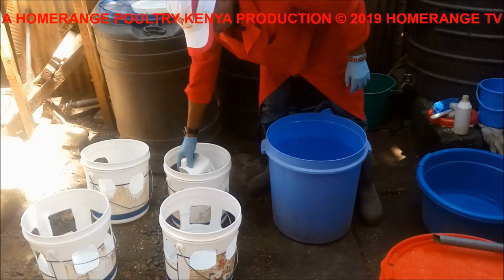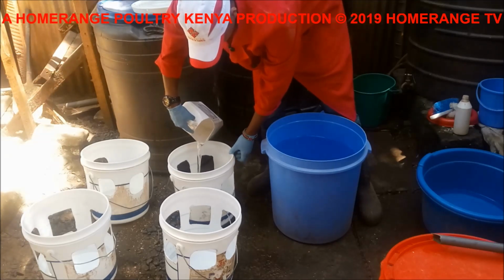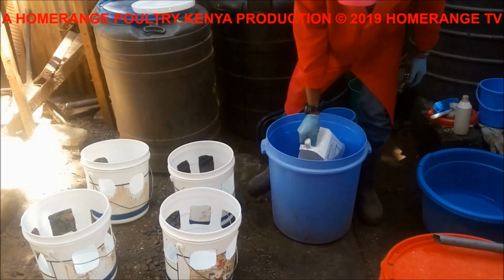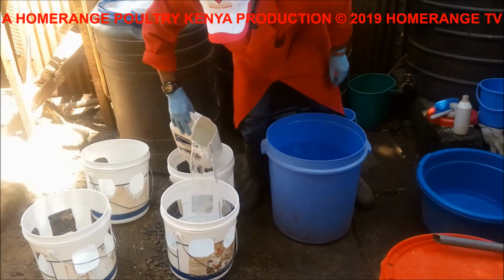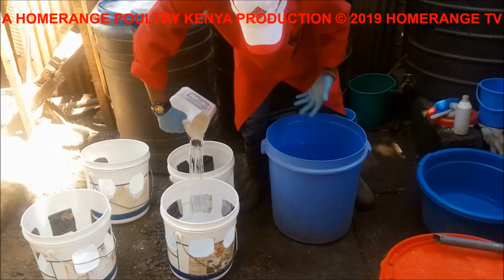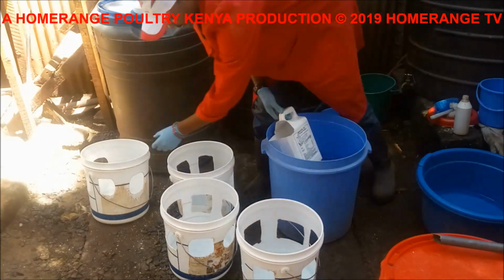Don't spill the water all over the place, because you need to remember that this is a virus that you're dealing with. You can easily start spreading the virus all over the place once you step into the water that drips. So be gentle, be very gentle. Also, I hope you notice that I'm working under a shade, not under direct sunlight, because direct sunlight will also destroy the vaccine. So there you go.